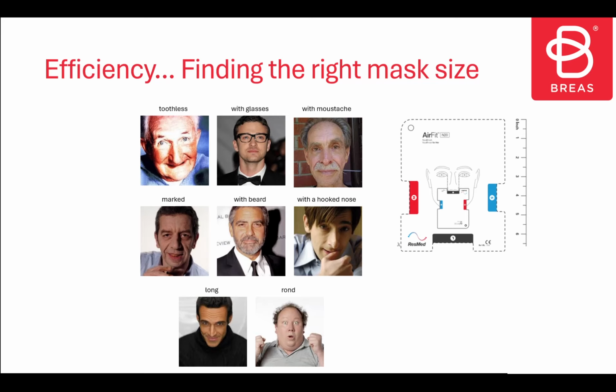There are patients who have a mustache, a beard, who have no teeth, for example, who have a slightly flattened nose, a longer nose, a round face. There are different types of faces. We have to adapt to each face and each size. It's very important to find a good size.